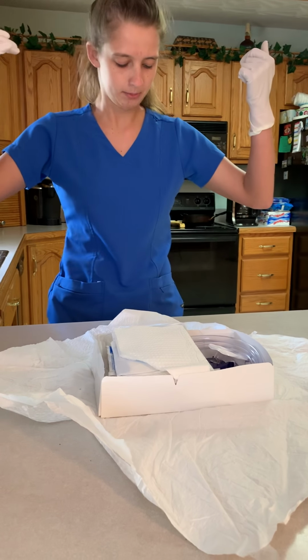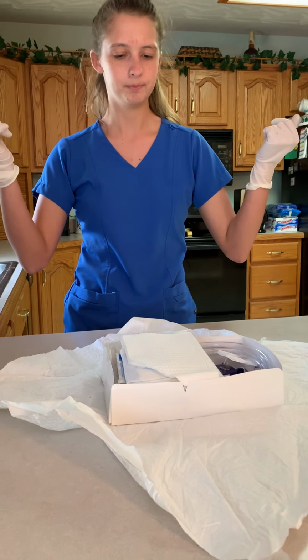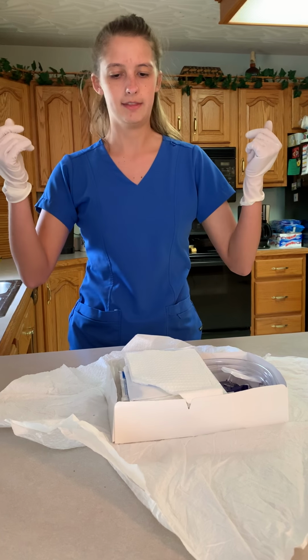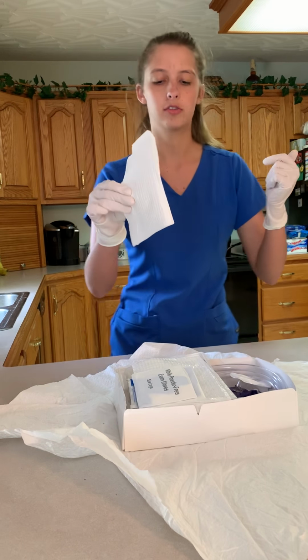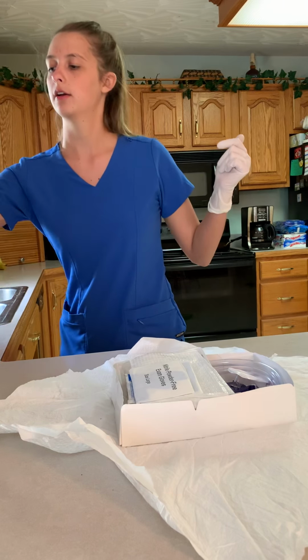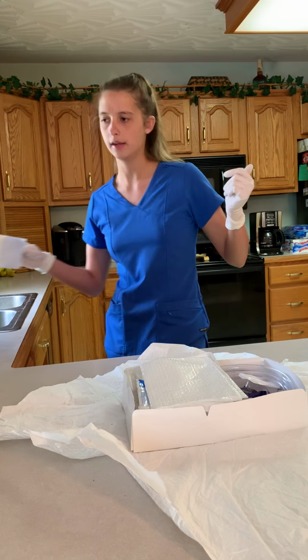So now what I'm going to do is get rid of anything that I don't need in my tray. So I don't need this. So I'm going to go out and away from the sterile field. And I don't need these gloves. So I'm going to go out and away from the sterile field.